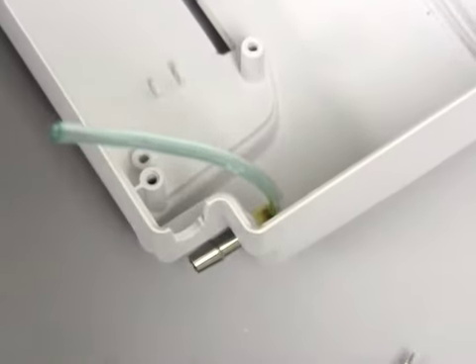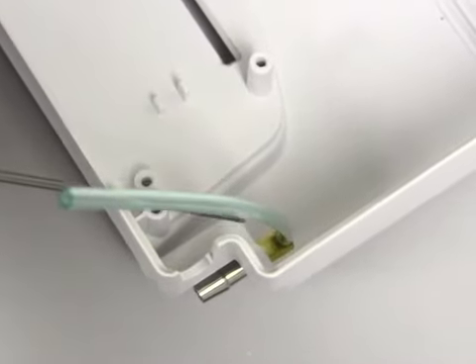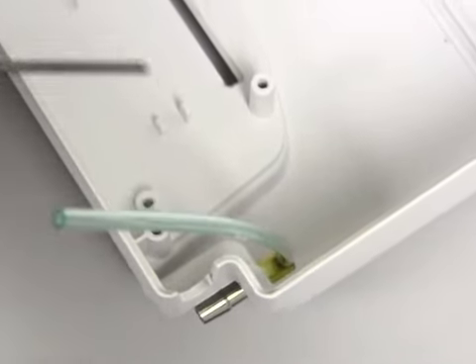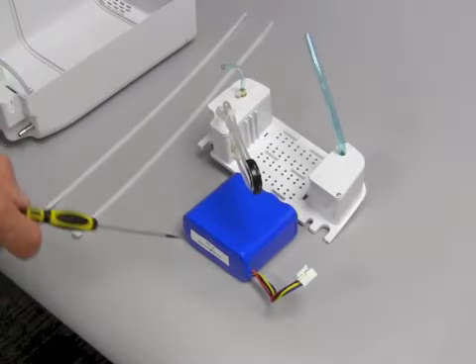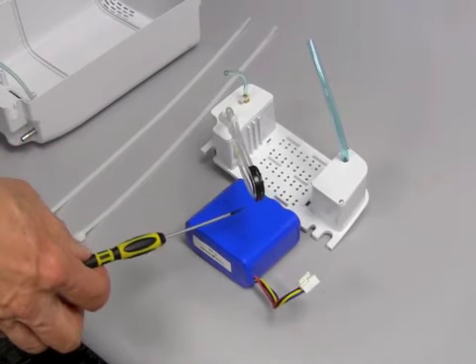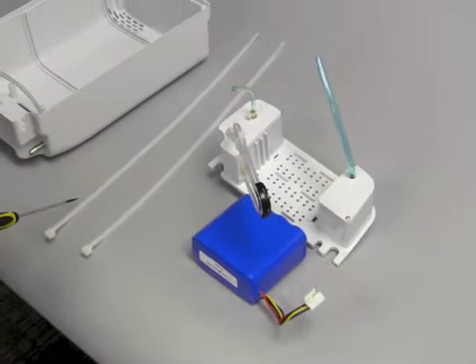Okay, this shows that I have now reinstalled the hose barb into the mating fitting and the Tygon is in place. Okay, the next step is to reinstall the reservoir, and when you do this, you'll have to reattach the battery to the reservoir using these large wire ties.